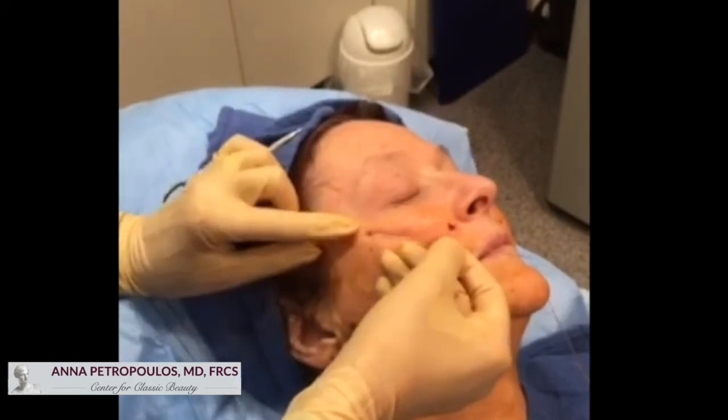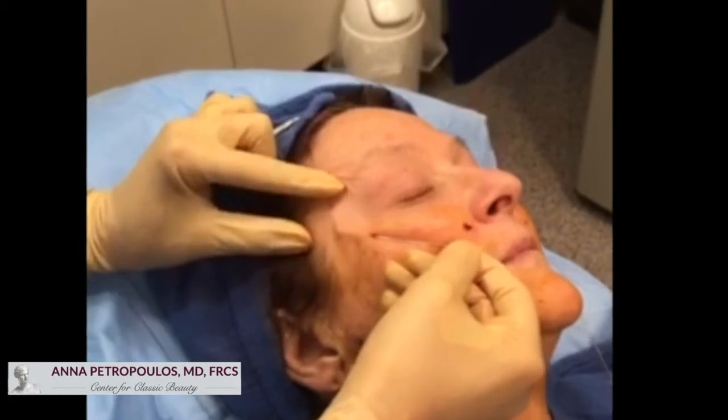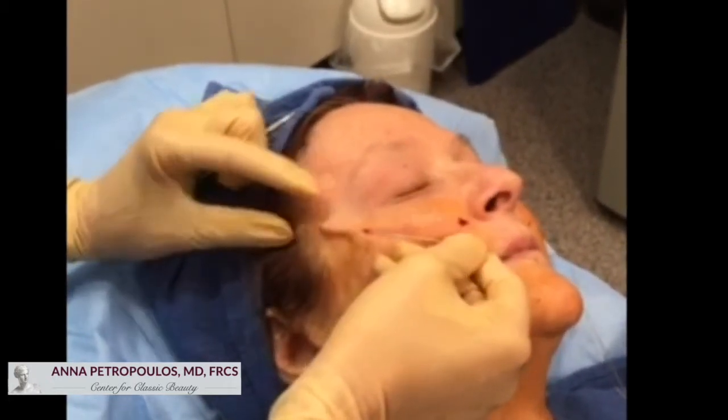There are quite a few blood vessels in this area, as we can see one here, so we have to go superficial to it so as not to puncture it.